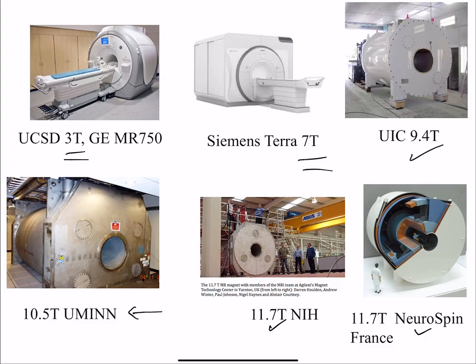They work in accelerators. I was just at CERN a year or two ago, and I visited the accelerators, and they have all these magnets there. So they have a lot of magnet expertise in France and in Switzerland. So they figured, oh, let's just use all this to build a magnet. We'll just get a bunch of physicists together and build this. And I think like 10 years later, they're still trying to get it to work because there's just so much engineering know-how that's gone into it. Okay, there's just massive forces being applied by the magnet on itself.